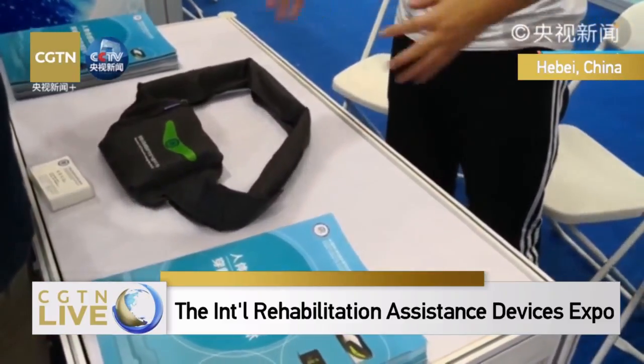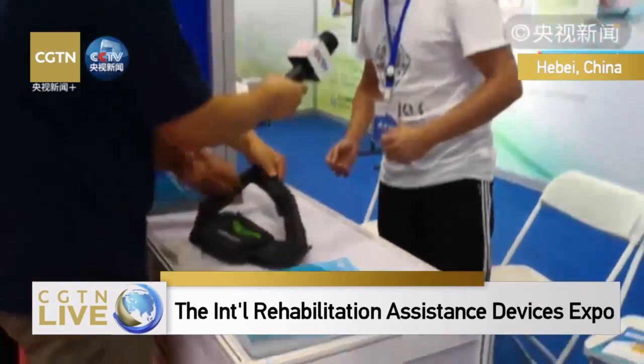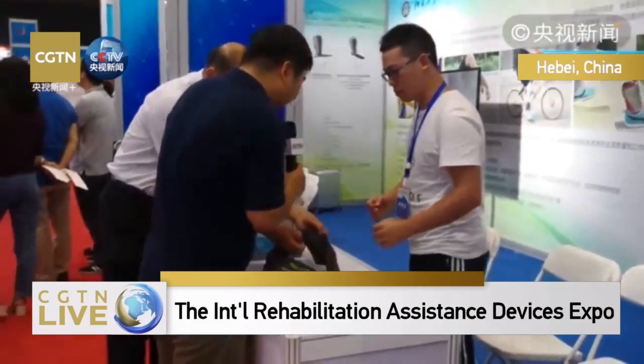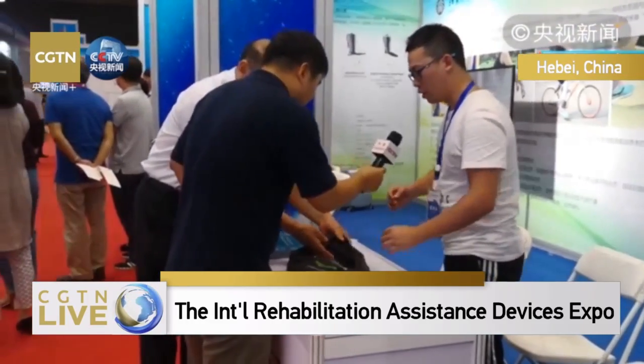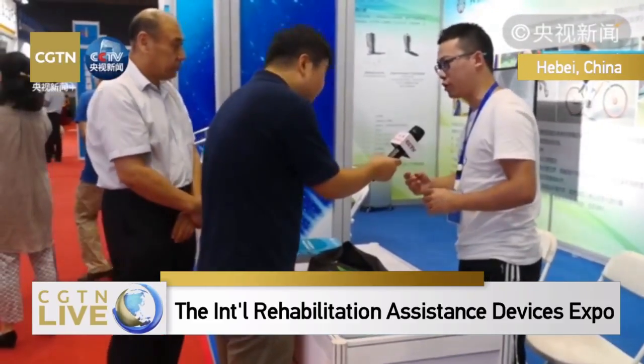You can just strap this at the elderly person's waist. In the case of a tripping, the airbag will come out and protect this person.